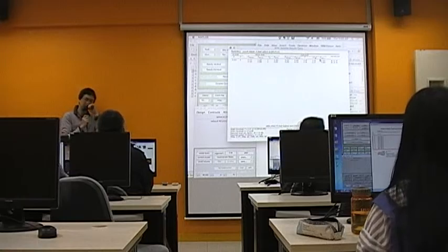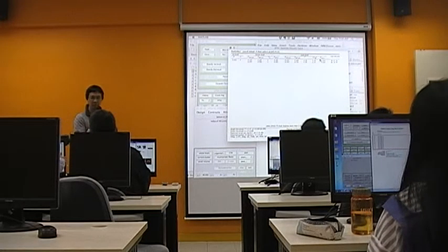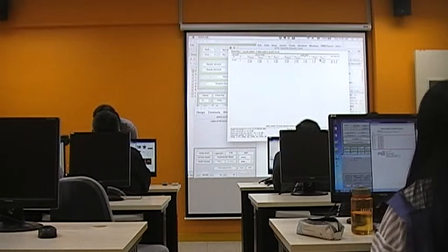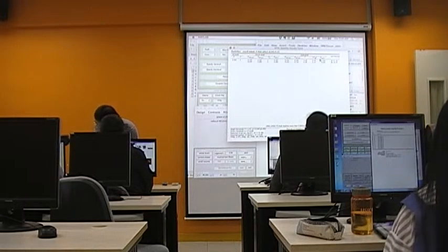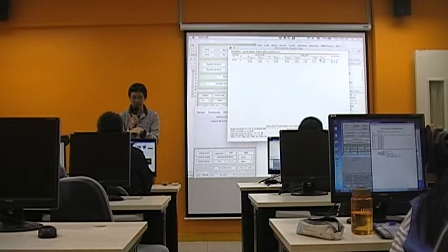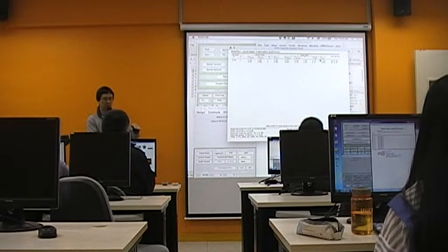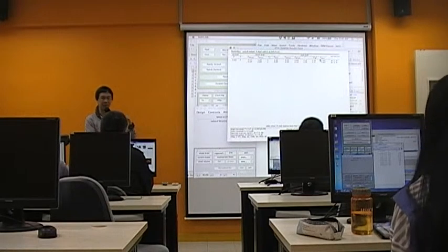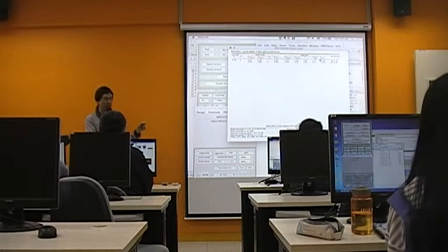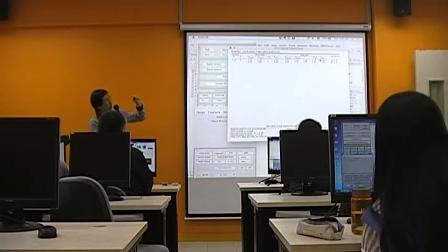This is only the threshold for data exploration, so it is relatively more liberal compared to the threshold here.